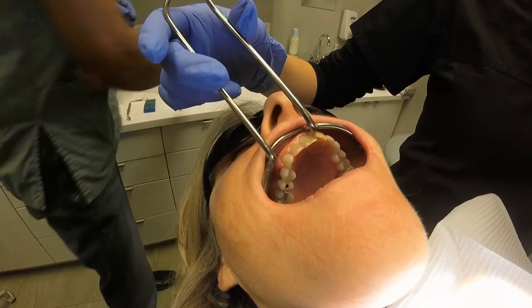Once it's torqued into place, remove the wrench components, and take a cotton plier or a hemostat. From a passive fit perspective, the first thing we're going to do is try the floss, and you can see the floss has a nice passive fit. The second way of assessing this is to use that shim stock. For demonstration purposes, you can see that the shim stock moves through very easily, demonstrating the passive fit that exists there. Check the occlusion.